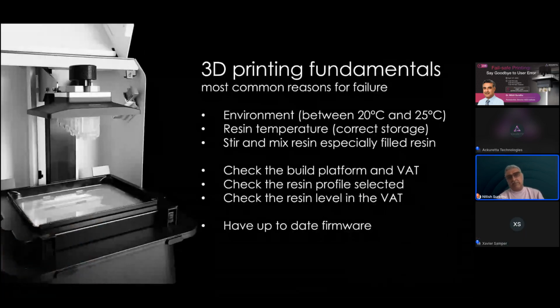I want to start with some basic printing fundamentals. I want to quickly say that if you don't get these things right, these are the most common reasons why prints fail. So it's very important to make sure that you're printing under the right conditions, that you're printing with the right materials, that you're using validated workflows, that you're using all the right components in your workflow in terms of everything that comes to be. And so it's very important that you create the right setup, the workspace in your own in-practice lab or elsewhere if you actually run a lab yourself.